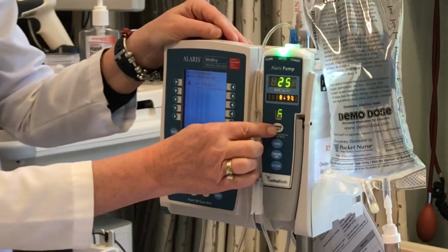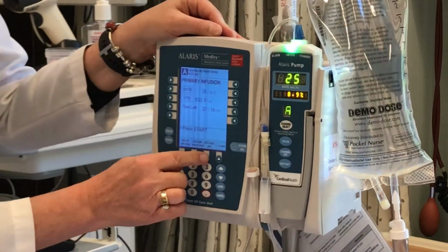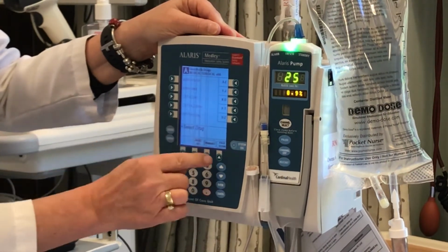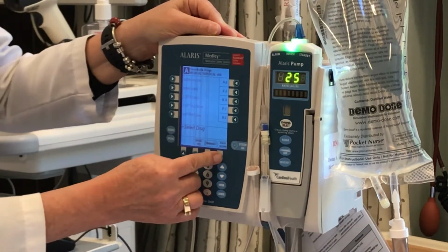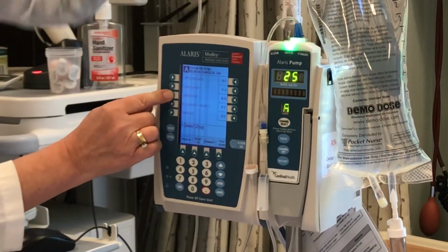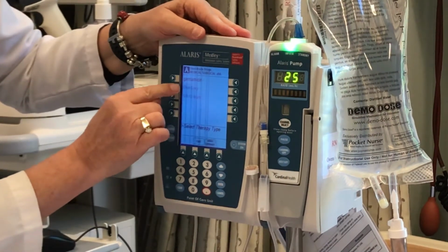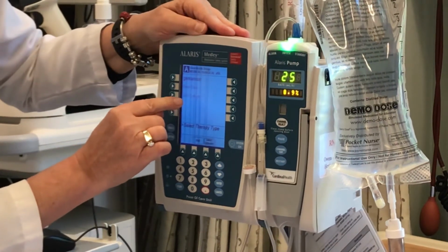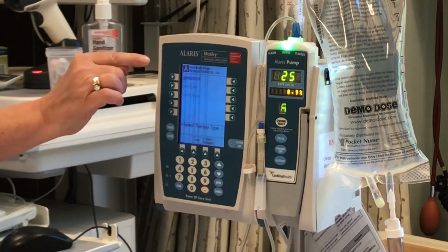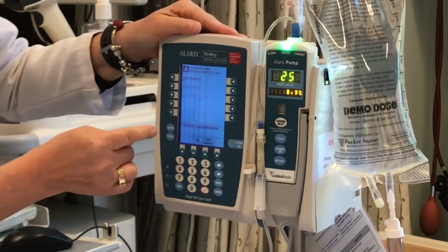Okay, so I'm going to press channel select and secondary infusion. And then I'm going to look for the medication that I am ordered to hang. So I'm going to page down and I find gentamicin, and I'm verifying that is the piggyback that I have. And then it says, is it once a day or every 8 to 12 hours? I verify again with my MAR that it is every 12 hours. So I'm going to select the second choice.